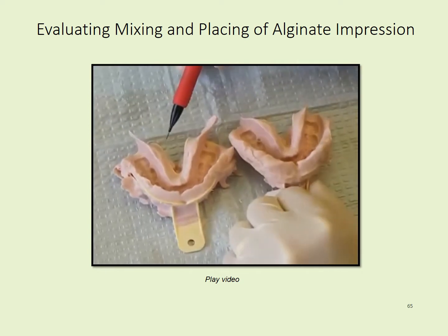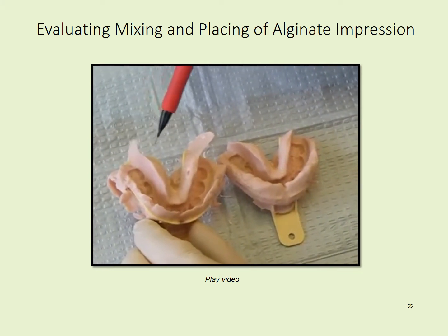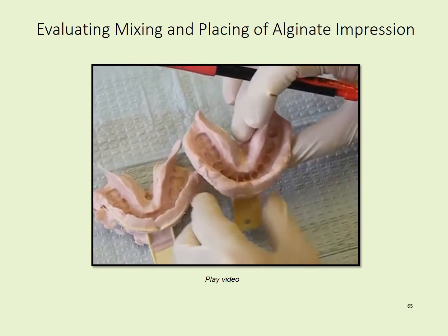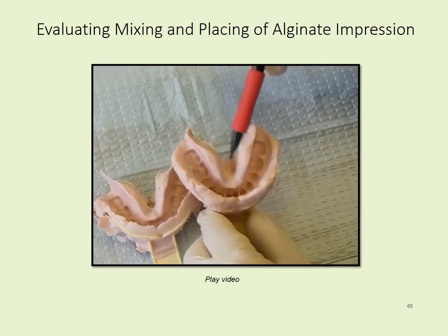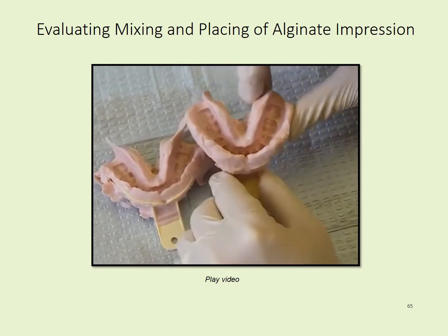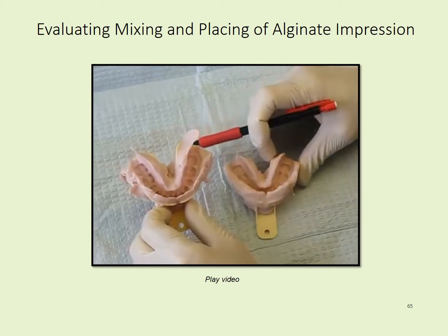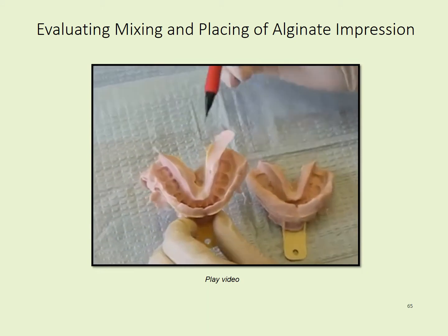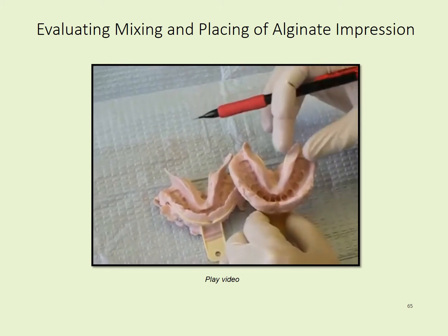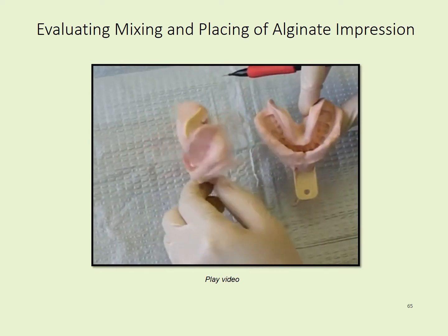If we also observe on the very back in the retromolar pad area or the back of the mouth, you can see these here are very thin, very flimsy, because again the material was wet and the muscles were pushing the material out of the way. Whereas on this, they are thicker, they hold their shape, and there's a much more rounded vestibule all the way through the mucobuccal fold, as well as on the inside, on the lingual. So in comparing and contrasting both of them, you can see the difference. You can also see how the tray back here on this one is actually showing through. And you can see the borders of the stock tray, whereas with this one, it's not as visible and it's a little more defined on the borders. Let's flip it over and see what the difference is between a runny and a perfect consistency.